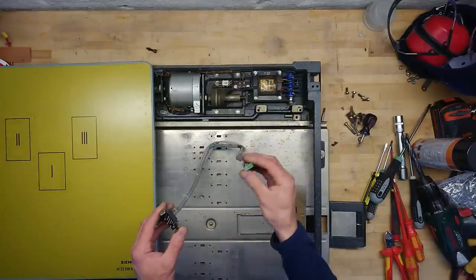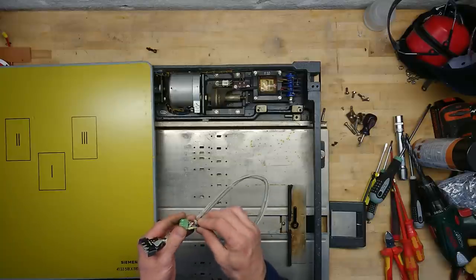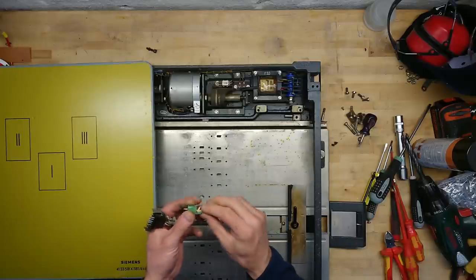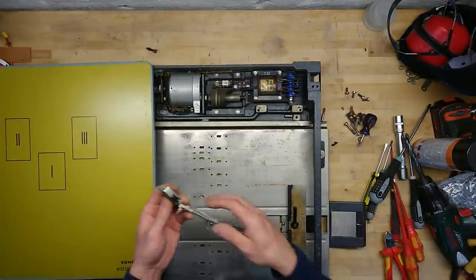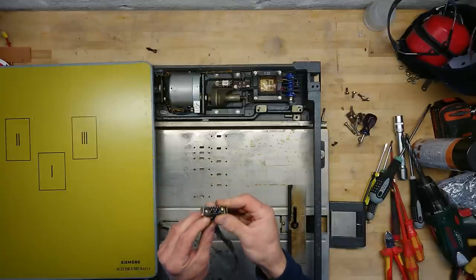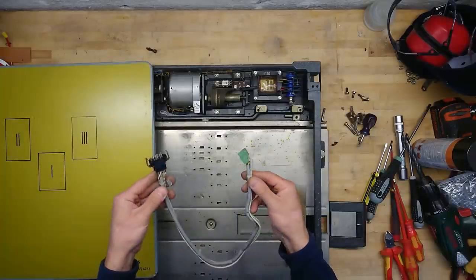But it connects to the outside world with this 10-pin connector. As we can see, it consists of three different cables. It's just a single ground wire, maybe. Then there is a multi-conductor cable and another single wire here. And the two single wires go over here, not really any ground pins or something like that, just single cables. Yeah, that's a little weird.